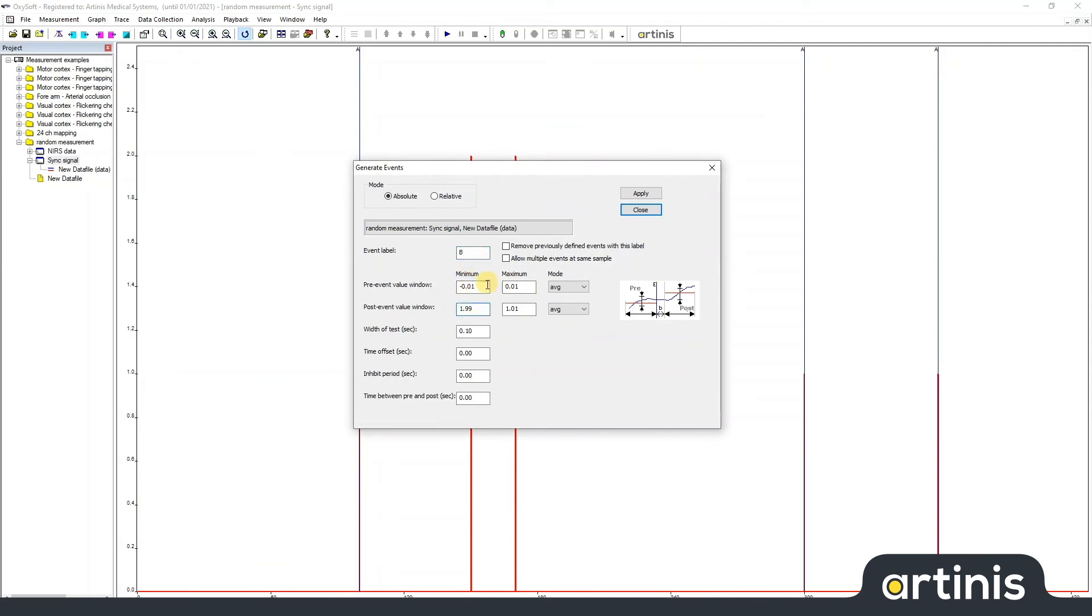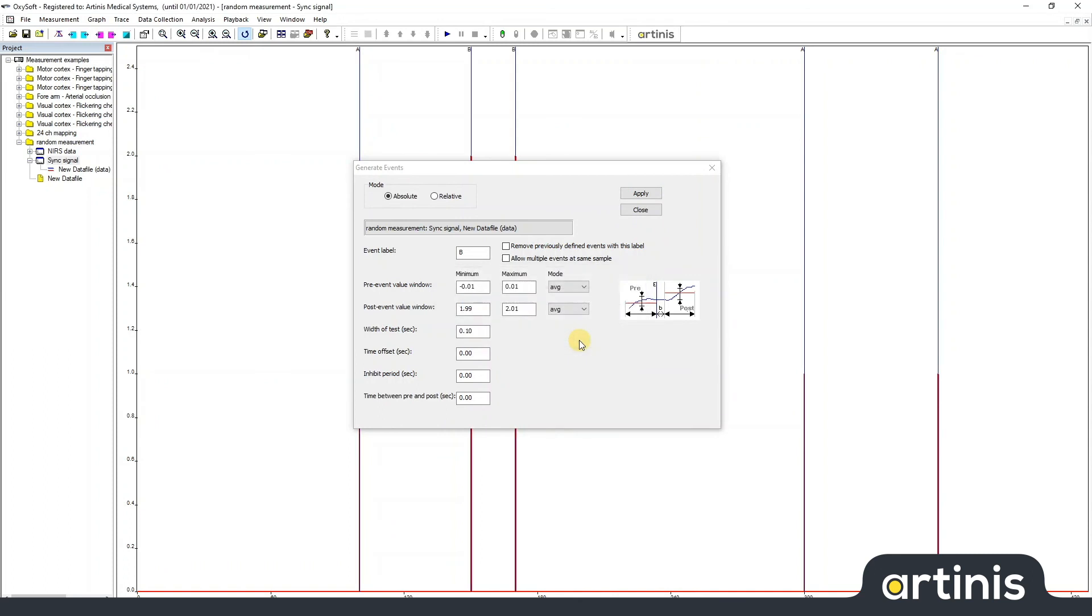So I simply change the after, post-event value. Now the other two are found.